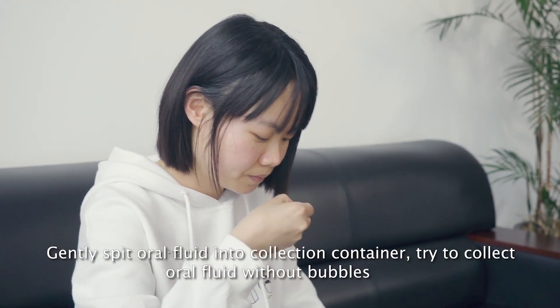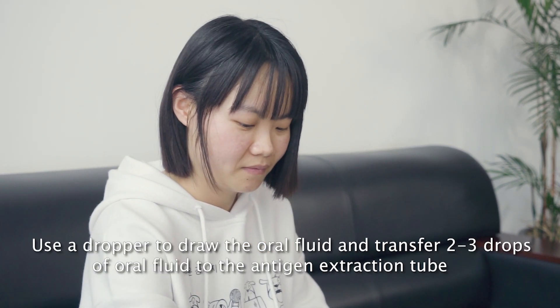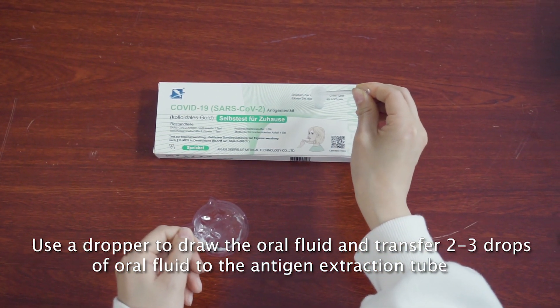Gently spit oral fluid into the collection container. Try to collect oral fluid without bubbles. Use a dropper to draw the oral fluid and transfer 2 to 3 drops of oral fluid to the antigen extraction tube.